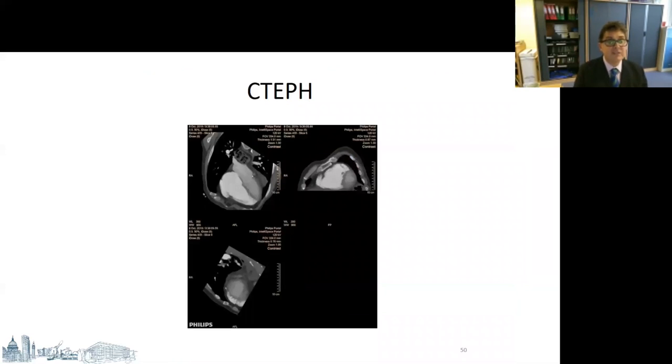And as these scans are performed retrospectively, fixed slice reconstructions can be performed throughout the cardiac cycle. This gives us a functional-like assessment of the RV, such as TAPSE, RV ejection fraction, as well as PA size. And when combined, the information provided improves the diagnostic accuracy, and hopefully the patient can then start therapy sooner.